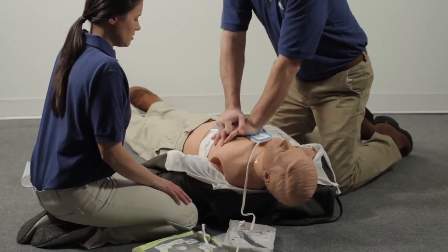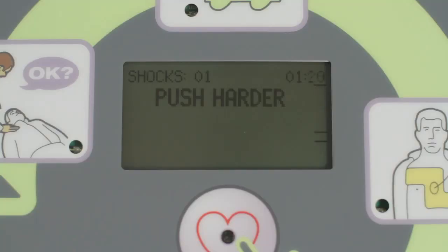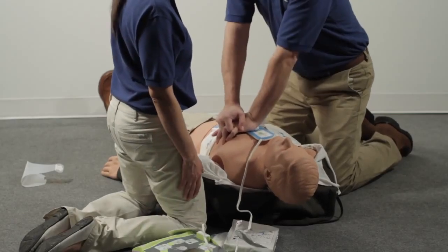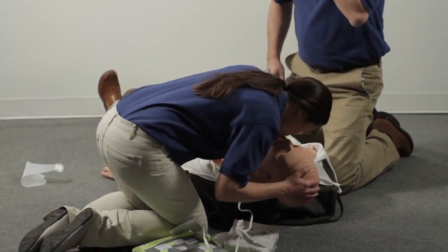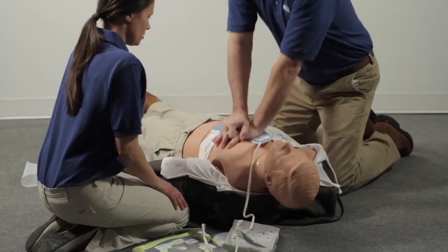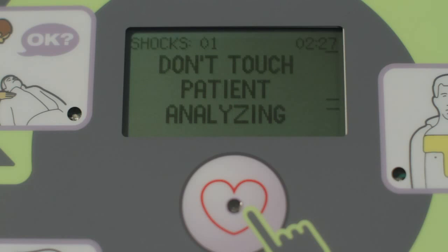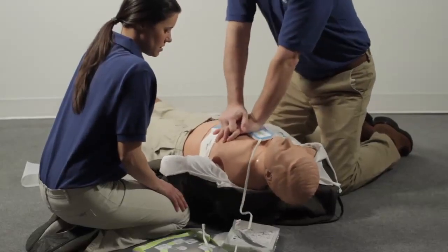Do five full cycles of compressing the chest 30 times and breathing two times. Continue to follow the AED prompts. If the AED tells you it is analyzing, do not touch the person. If the AED tells you a shock is needed, be sure no one is touching the person before you press the shock button. Continue to follow the prompts and provide CPR until help arrives or the person wakes up.